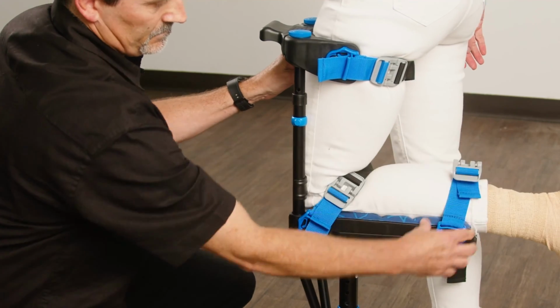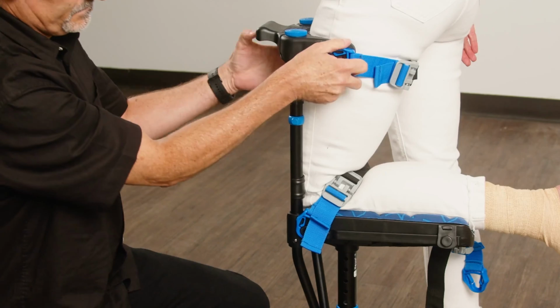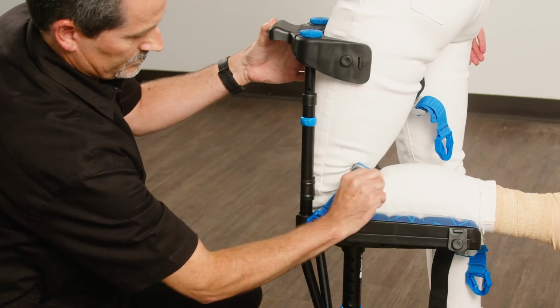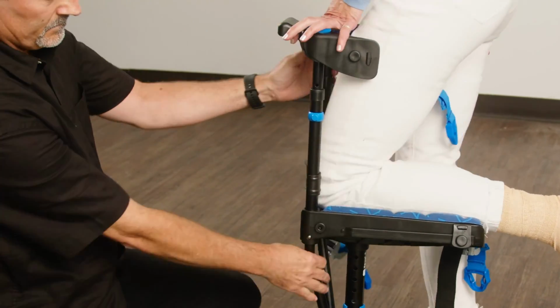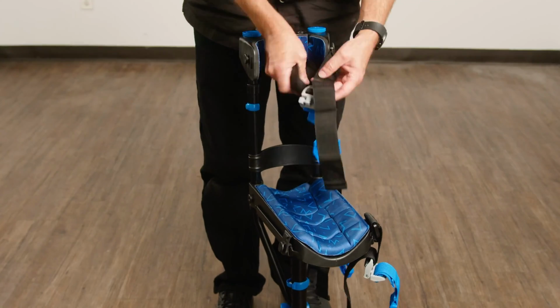Now remove the crutch from the patient. Start by loosening the straps, then remove the blue buckles. Remove the crutch from the patient and install the 3 pads.